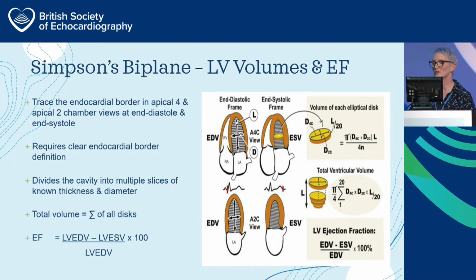Some people wait till the end of the study to do the actual trace. I would recommend, if you're going to do that, freeze and scroll through your loop, because what looked like you could see it fine whilst it was moving, when you actually scroll to the frame you want to measure, it's not always as clear as you first thought it to be.